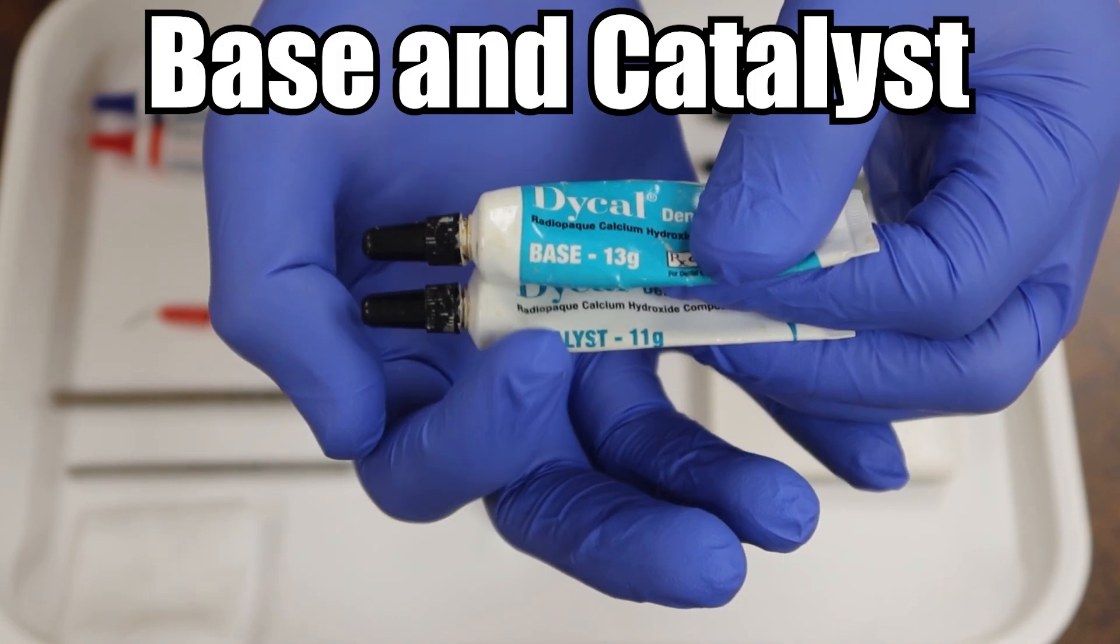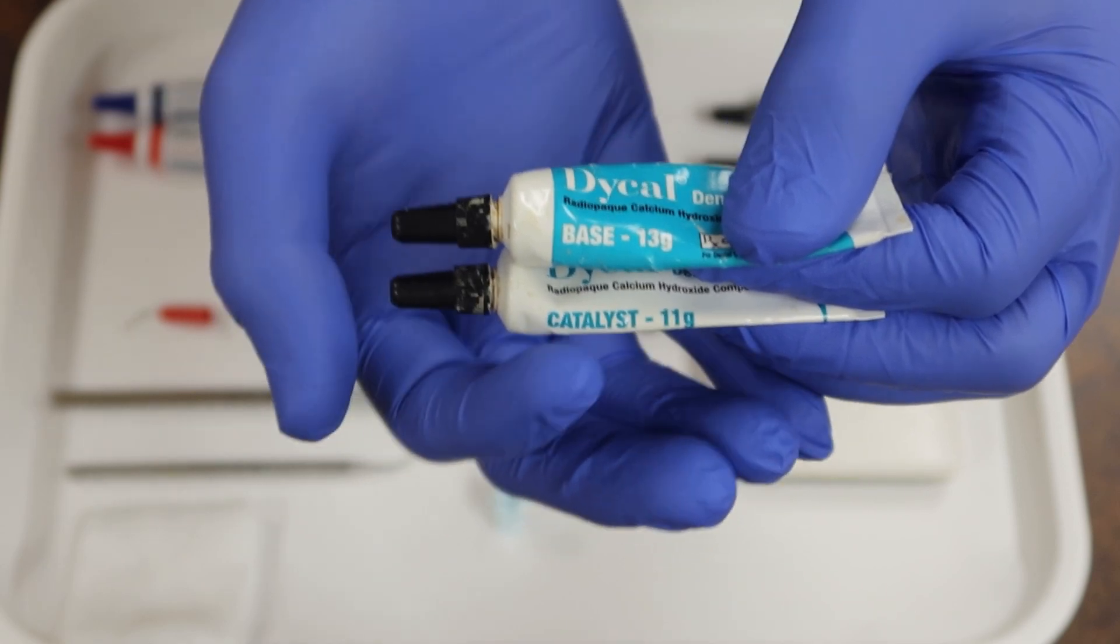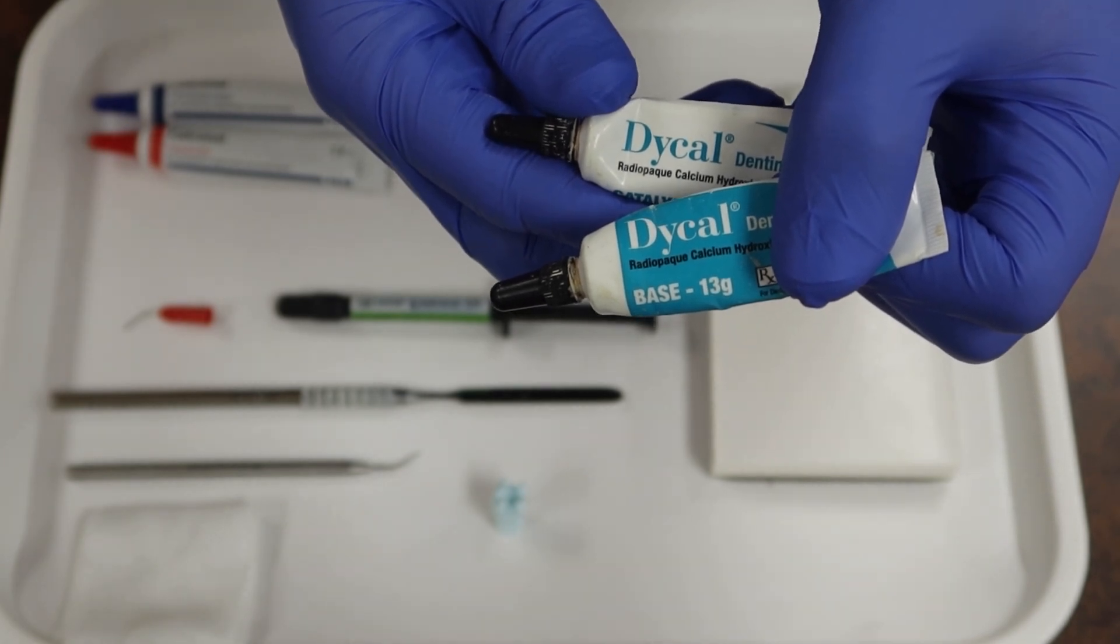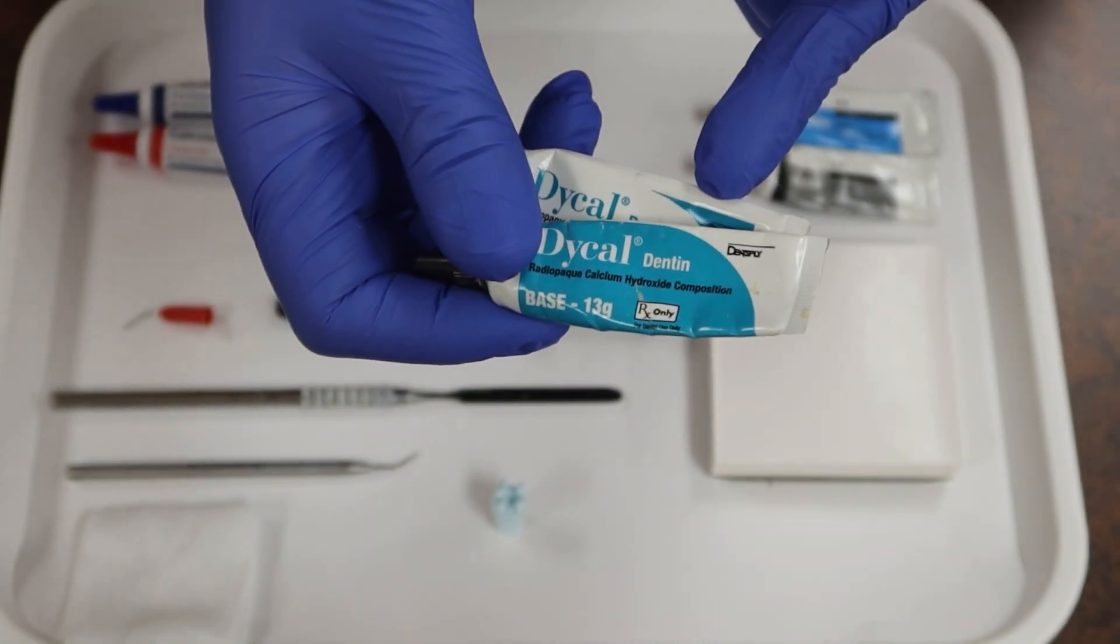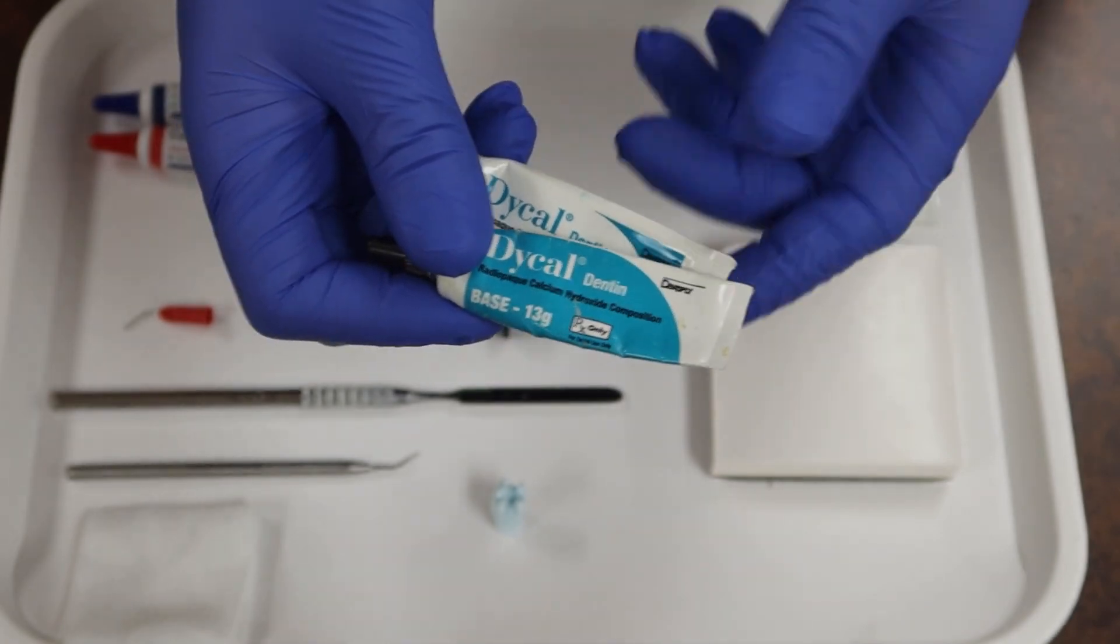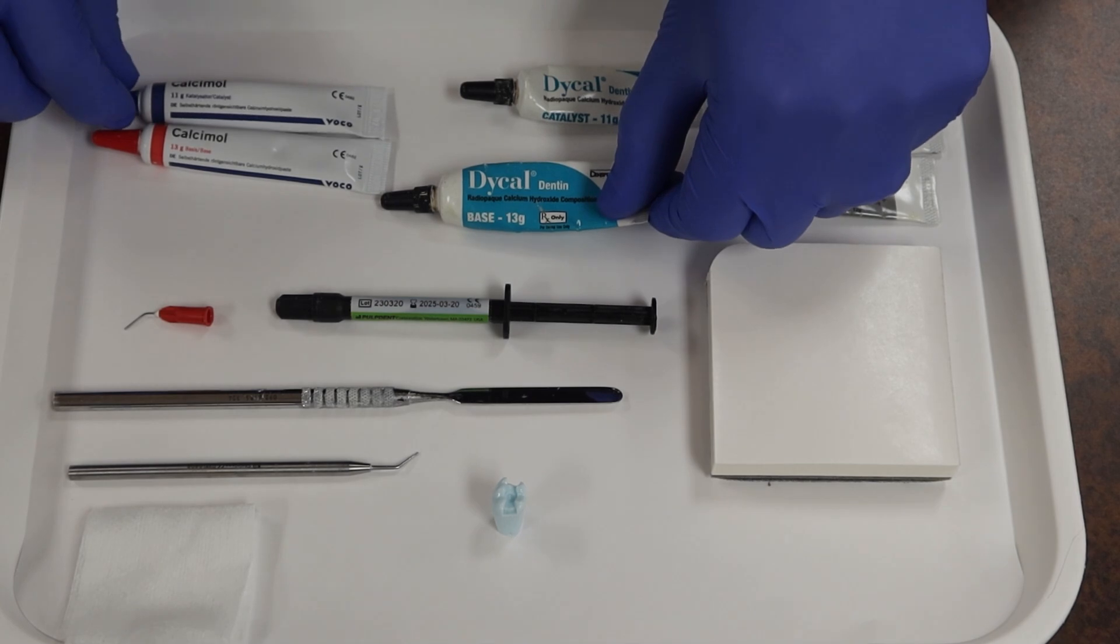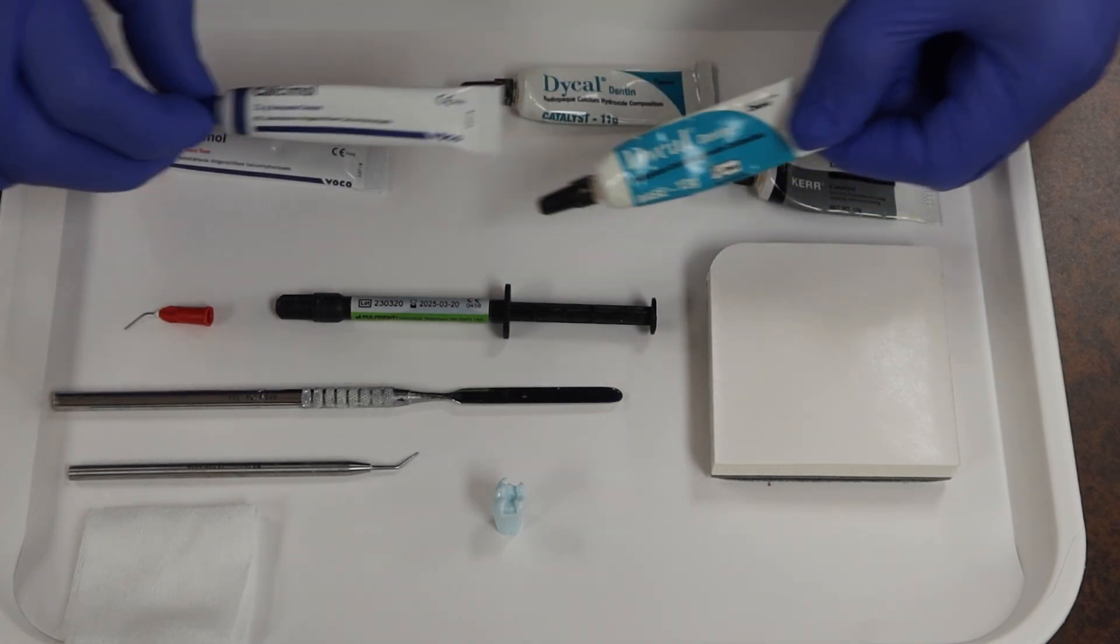Some of them are going to be called a base, some of them are going to be called catalyst and you're going to want to make sure that they are of the same brand. Such as right now we're using Dycal and that is of the brand Dentsply. And so we don't want to go and cross contaminate using my base from Dycal over with my Calciumol catalyst. They are just not going to jive together.